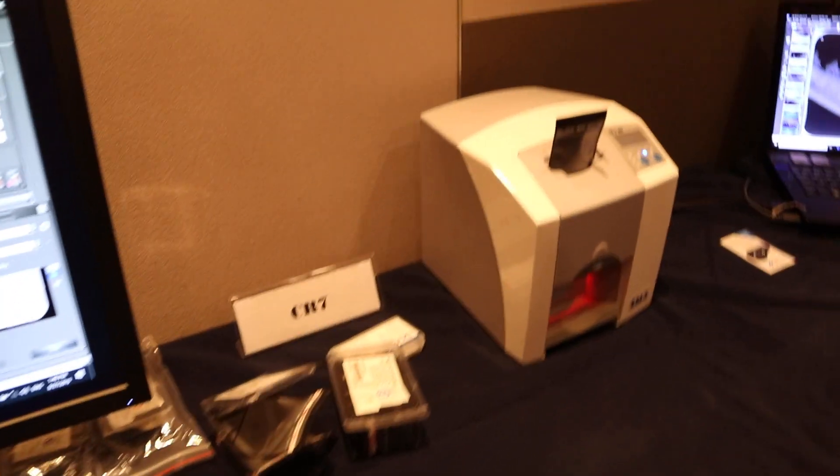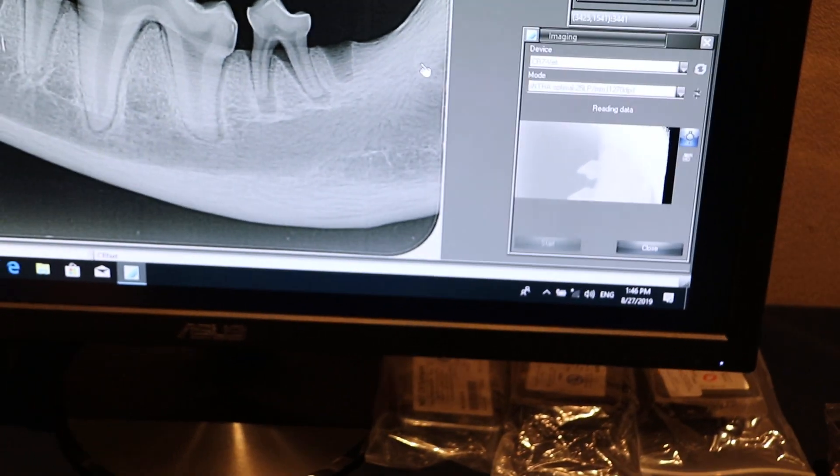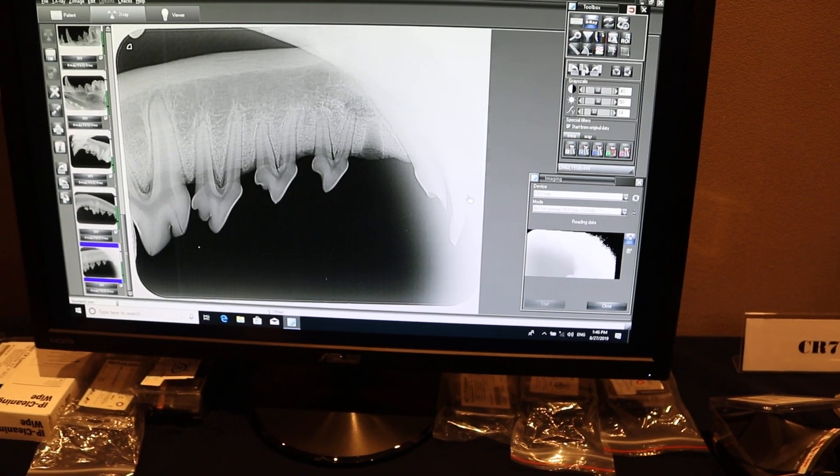As long as you don't fold it and crease it yet, they do give it — all your angles are very good. If you're wondering what this is, once the thing grabs them, it actually can... It looks like art, doesn't it?